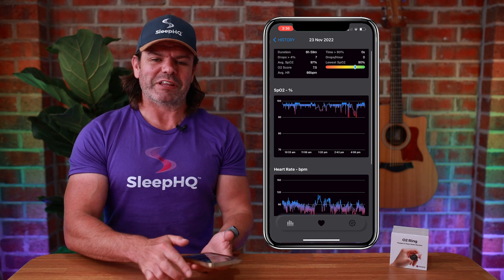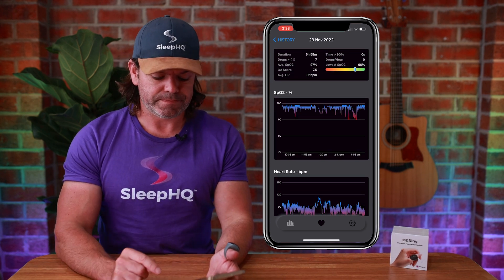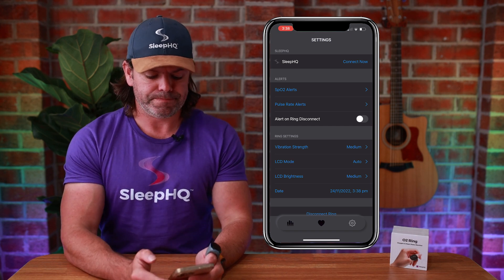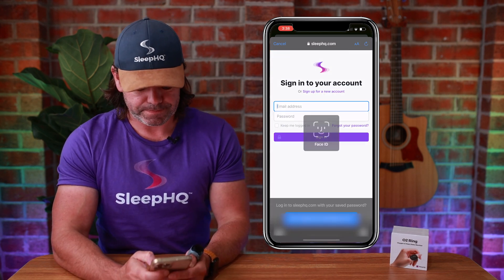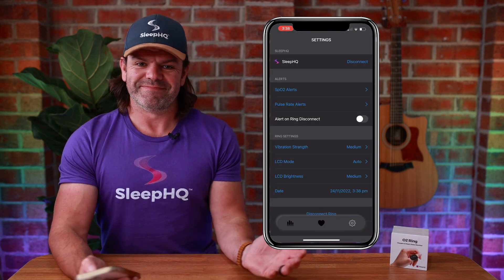Now let's talk about the fun stuff — let's connect up a Sleep HQ account. Go to Settings up the top, click Connect Now, then Sleep HQ. Put in your Sleep HQ details, sign in, and you're connected. It's as easy as that.